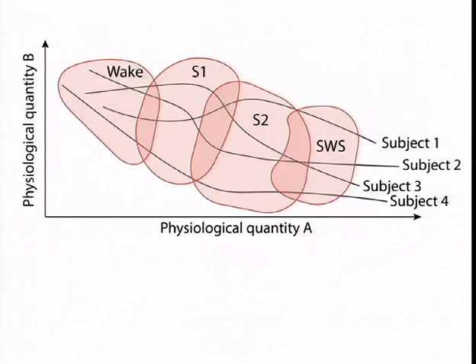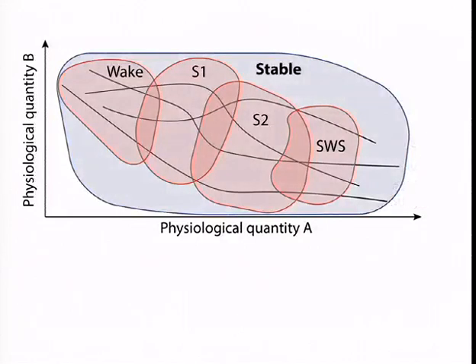So these states now correspond to the typical behavior, or the typical signals that we'd measure, but a superset of them would be a set of all healthy brain states, and I've labeled them stable here, but they could well just be labeled as healthy. So oscillations that are not associated with pathologies like seizures. And we might say that if we were sitting out over here, we might be a subject who has a particularly unusual EEG spectrum for whatever arousal stage they were in. And so this would reflect just normal individual variability.